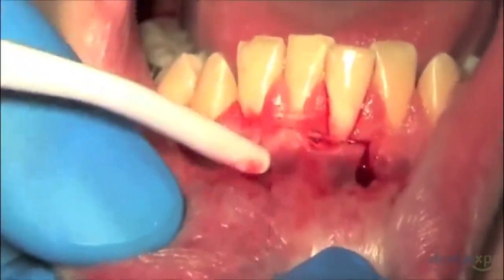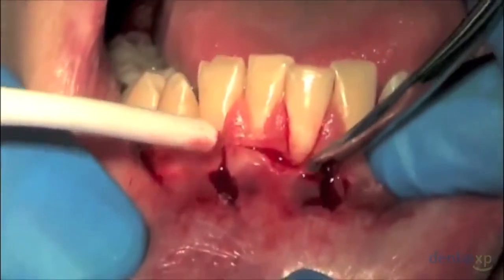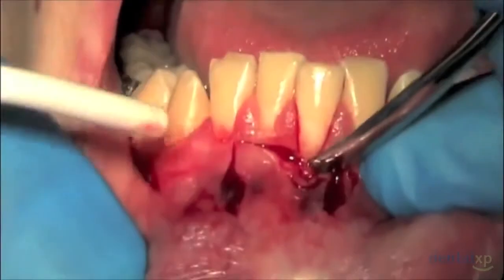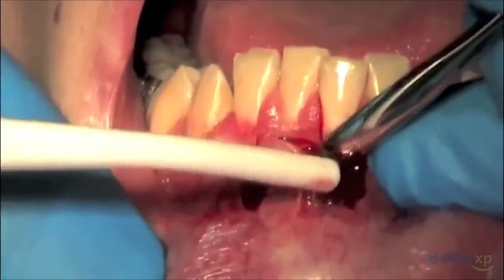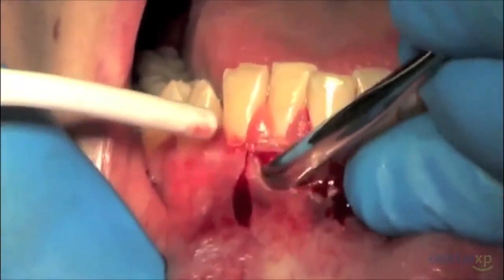I do this by using a blunt instrument, in this situation a Pritchard periosteal elevator, to initiate separation of this loose, thin mucosa from the root surfaces.